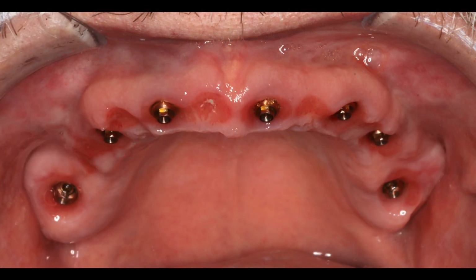And I like to show these pictures too because it shows the soft tissue maintenance or soft tissue development that is accomplished with that temporary. The redness you see is usually just an allergy to the acrylic resin we use for the temporaries. Once the zirconia permanents are in there, that pinkness usually resolves completely.